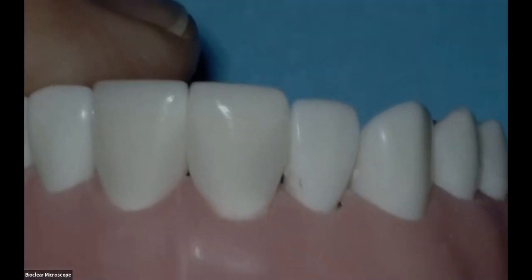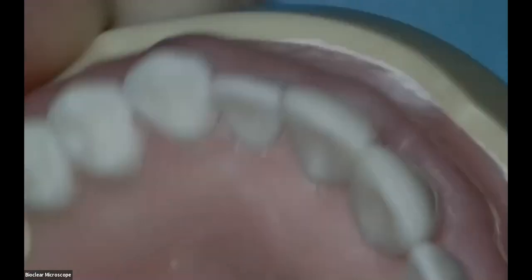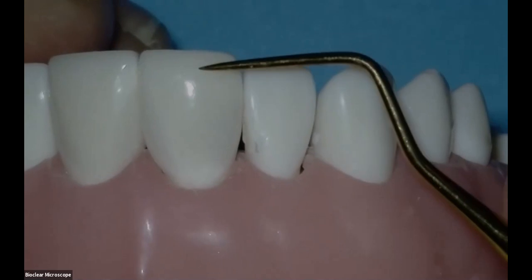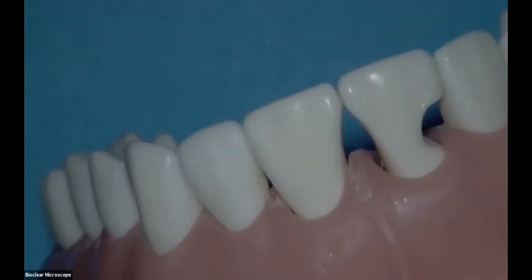Yeah, and so this is the full Bioclear method with a radius bevel, additive dentistry. We added about 0.5 millimeter of fullness with Filtek Supreme Ultra, and the blending now is perfect. And the thing is, this dentiform is crazy white, so to match this is very challenging. So that's our goal.